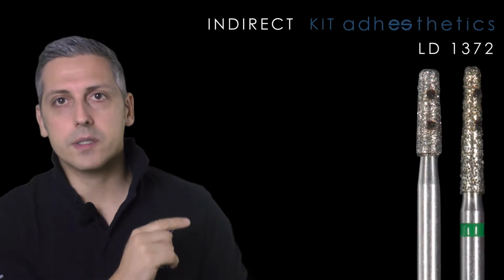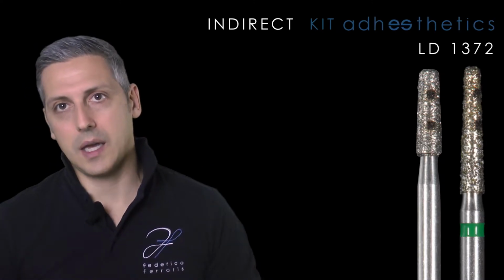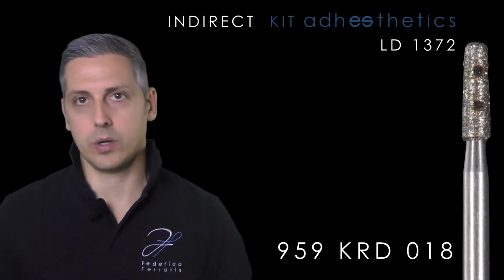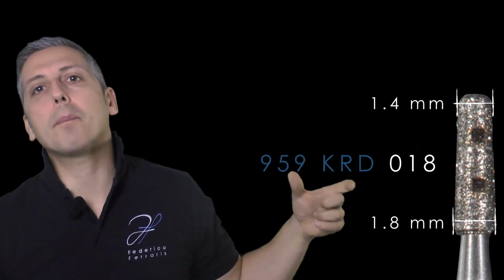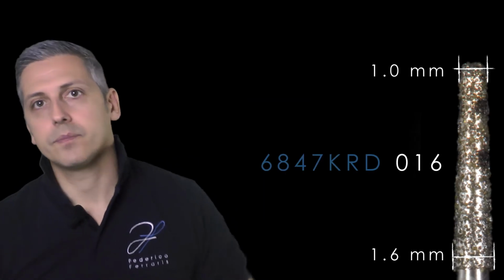Another thing you have to remember about these two burrs is that one is 1.8 millimeters in the largest working area, and the other one is 1.6 millimeters. But what is interesting for us is the working diameter at the head, at the apex of the working area. If you consider both, from 1.8 millimeters you will achieve 1.4 millimeters, and from 1.6 millimeters you will achieve 1.0 millimeter. This is very related to the depth of the shoulder that you want to create, or the aspect of the preparation. But for today that is enough, and we can talk about this aspect in another video, in another tutorial.